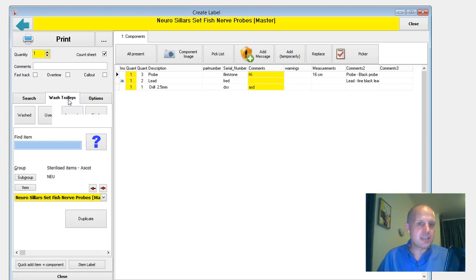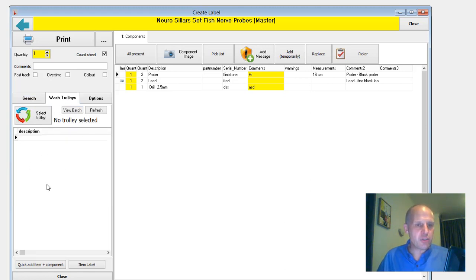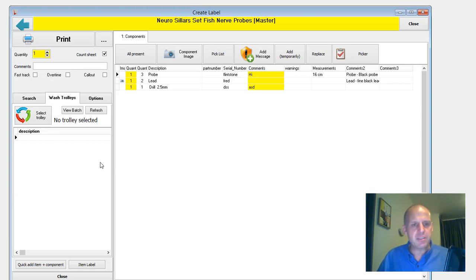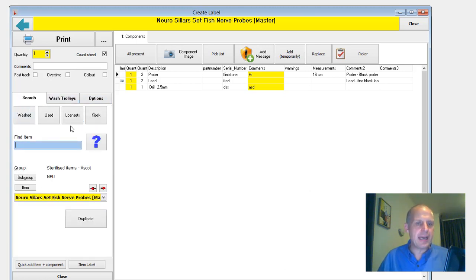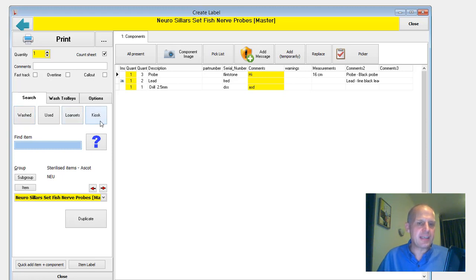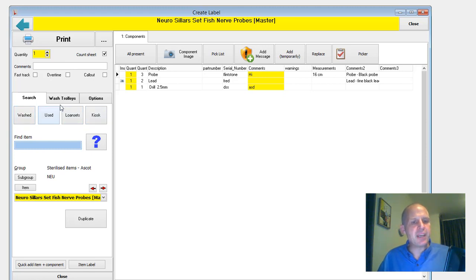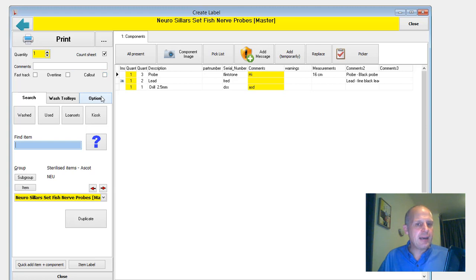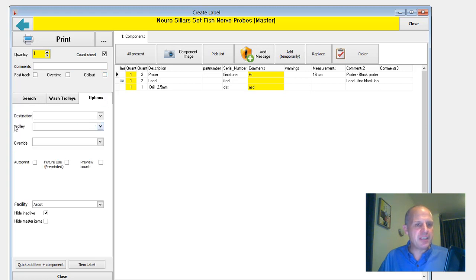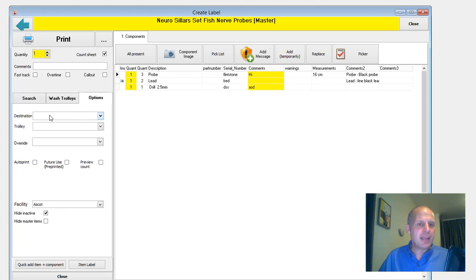If you're for St. George using the trolleys, you've got the washed trolleys here showing all the items that have been on. Oh, so the trolleys and the items. And so this is now your search capability on this one tab, washed, used, loan sets. And I'll talk about kiosk in a minute and washed trolleys. And I've got some of the options up here, fast track over time, call out. And I've buried some of the options that aren't used that often down in here.